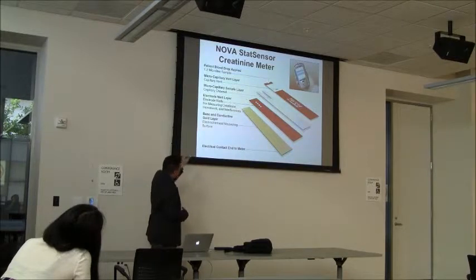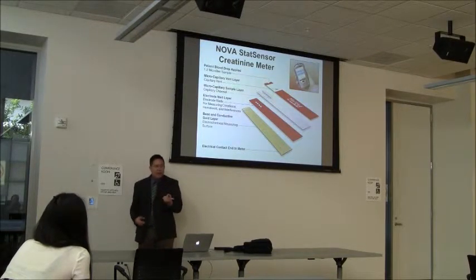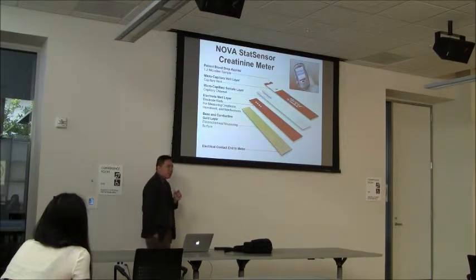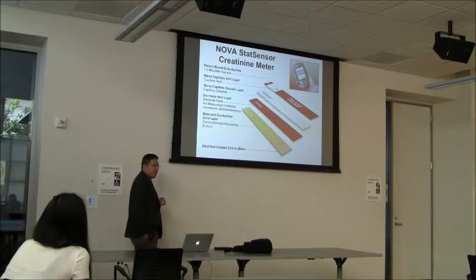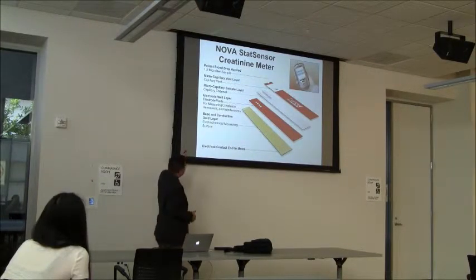What's very fascinating is it actually incorporates a 4-well electrode here, which can correct for factors that make point of care measurements inaccurate. We've shown since 2000 that things like how many red blood cells you have in your blood can actually alter the results of simple things like glucose, to the point where it actually impacts patient care. These things are now top of the FDA's list. Literally this week or this month, the FDA has pulled devices off the market for not being sufficiently accurate for our ICU patients. And this is one of the issues that caused these devices that used to be everywhere to be inaccurate.